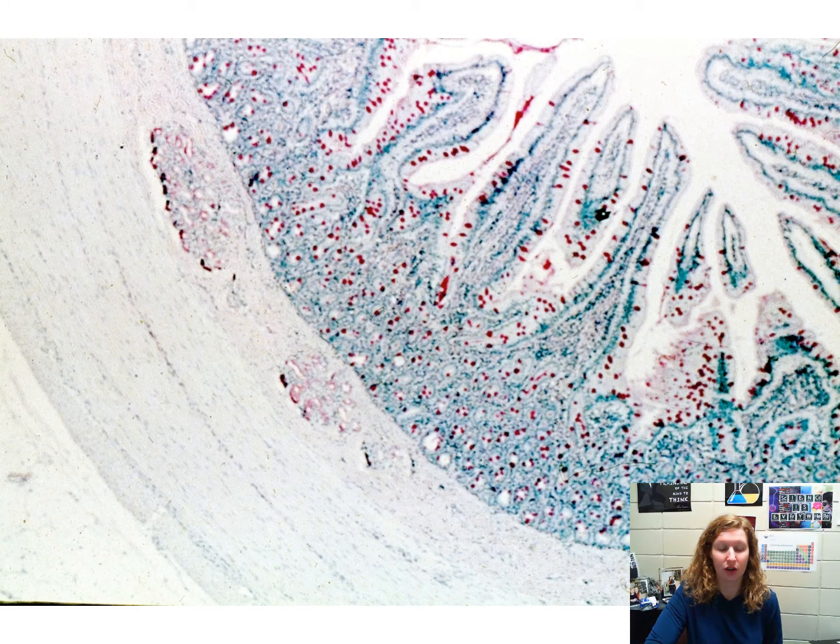This is another shot of an entire organ. So the lining of the small intestine, see if you can note the epithelial, the connective, and the muscle tissues.